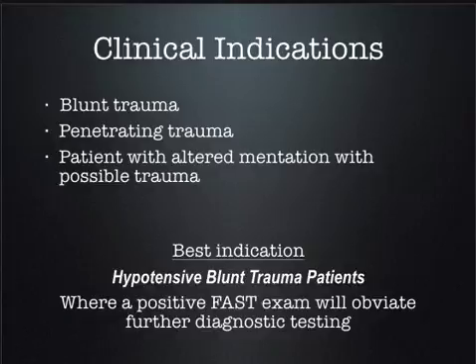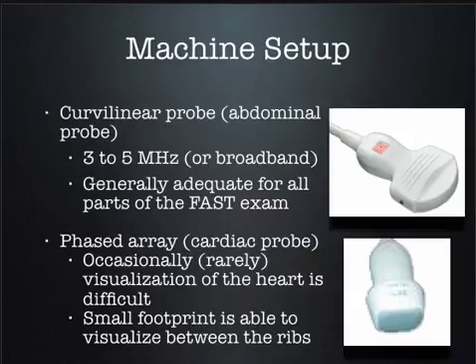But in trauma patients, the reason why a FAST exam is great is because if you've got a hypotensive patient that got hit by a car, and you do their FAST exam, and they've got a belly full of blood, you don't need to go to the truth machine. You know what's wrong with them, something. You don't know exactly, but you need to go to the OR and get it fixed. So it obviates the need for any further diagnostic testing. You can move on with life.